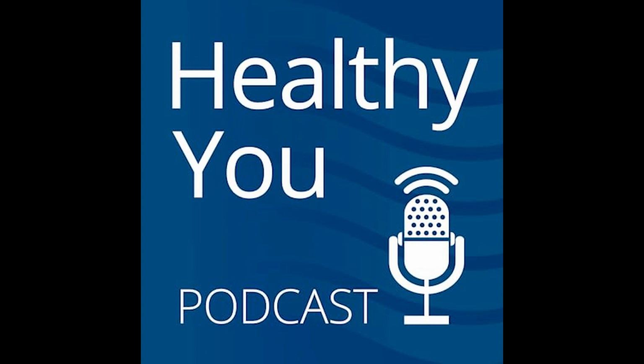I think it's also tricky because we hear all this information about Omicron being more prevalent in the throat. And so people are getting negatives in the nose but positives in the throat. And it's like, what do we do? Should we just swab our throats? The quick answer to that is no, follow the instructions exactly.